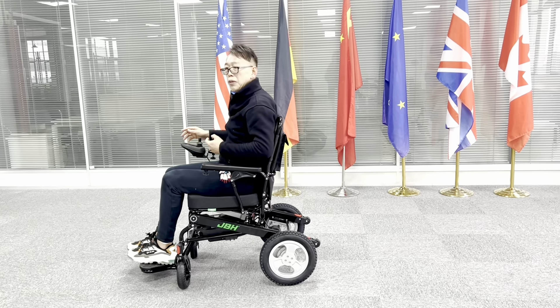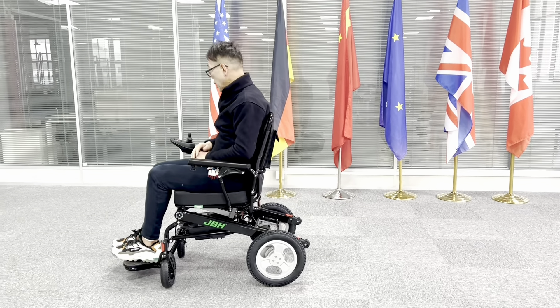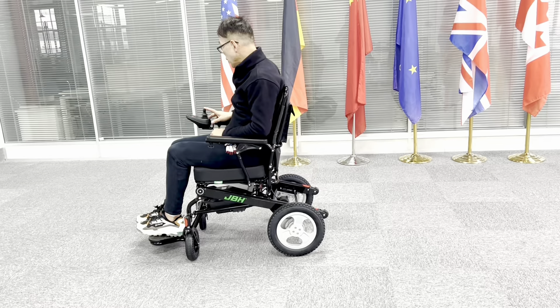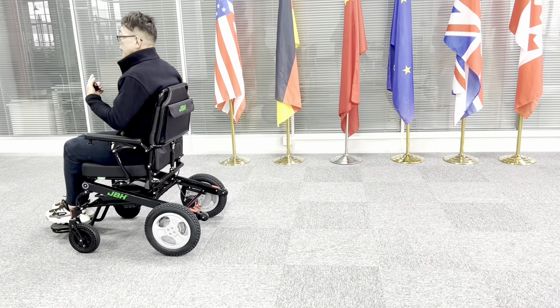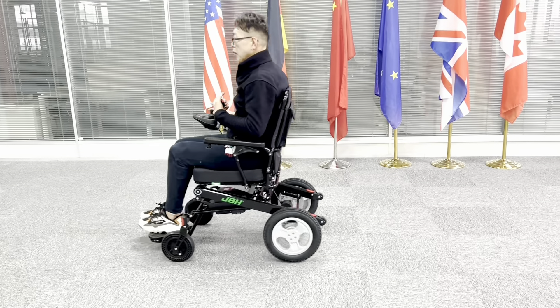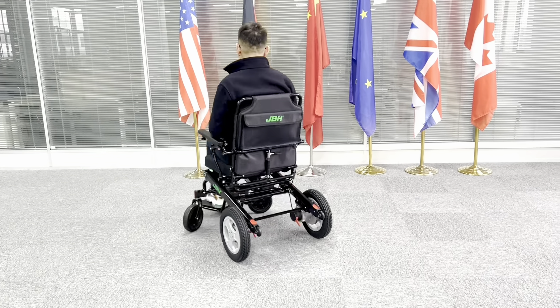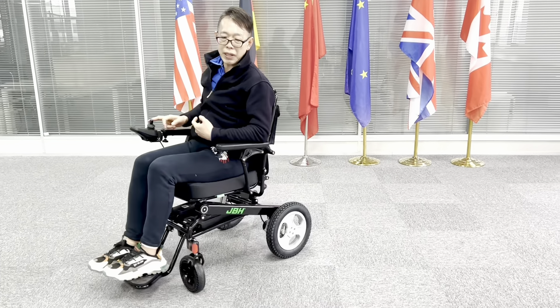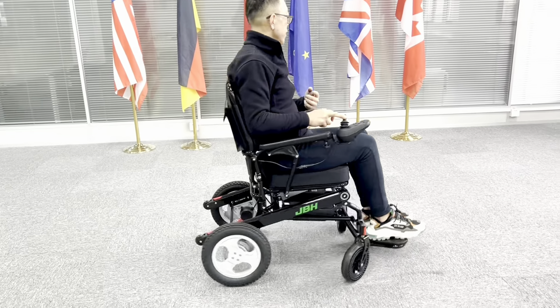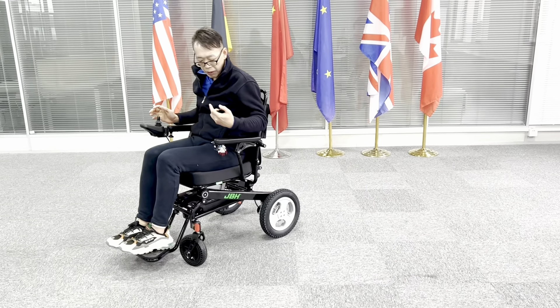Control of the wheelchair is simple and easy. Turn the switch on with one finger for the joystick control. You can control it backwards or forwards with a 360-degree function. Very tight turning radius so you can easily access any tight space.